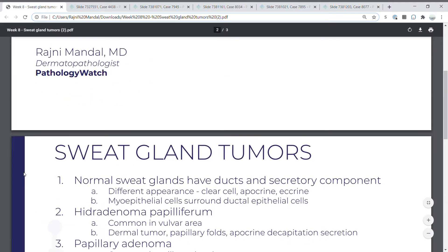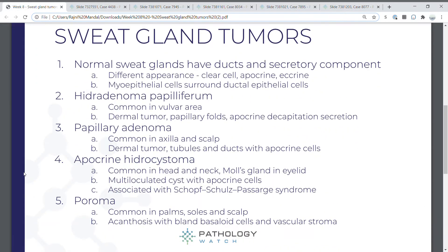Here are your five flashbacks for today. Normal sweat glands have ducts and a secretory component with different cell types — clear cell, apocrine, and myoepithelial cells surrounding the ductal epithelial cells. Hidradenoma papilliferum is common in the vulvar area — a dermal tumor with papillary enfolding and apocrine decapitation secretion. Papillary adenoma is common in the axilla and scalp — a dermal tumor with tubules and ducts lined by apocrine cells. Apocrine hidrocystoma is common in the head and neck and Moll's gland in the eyelid, is a multiloculated cyst with apocrine cells, and is associated with Schopf-Schulz-Passarge syndrome.